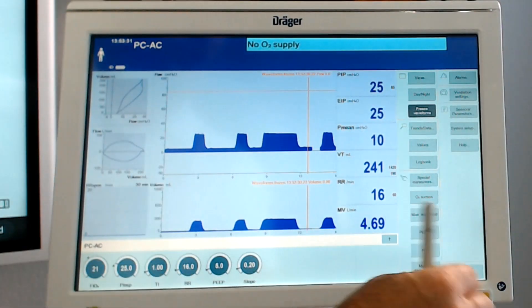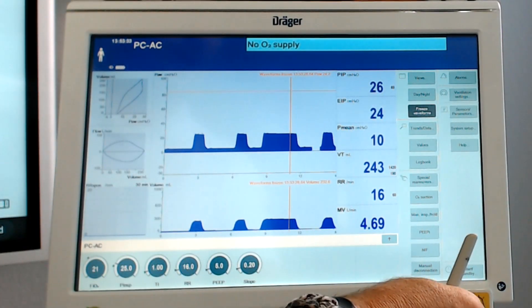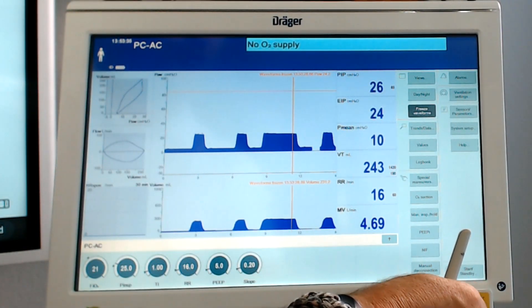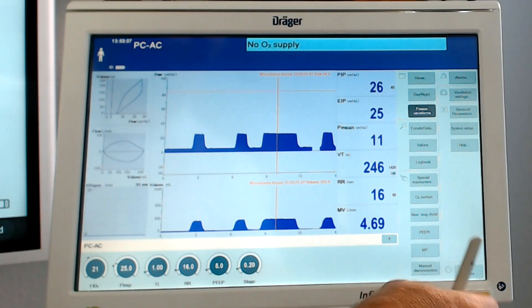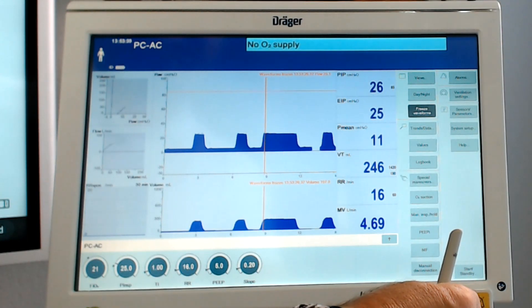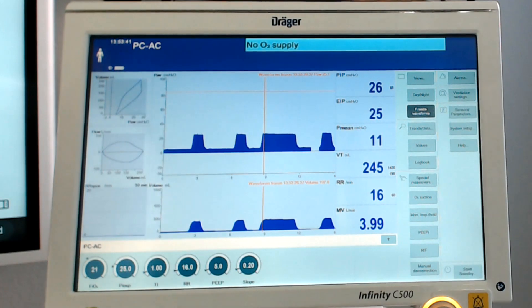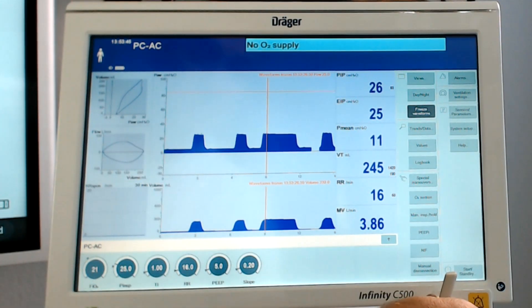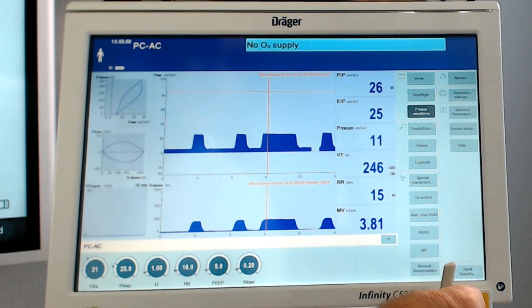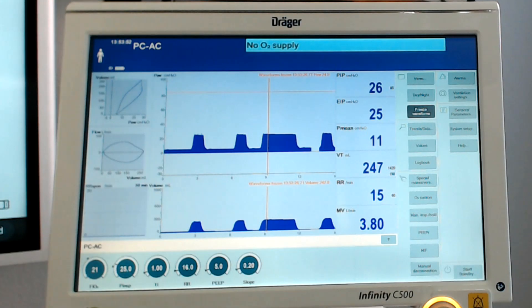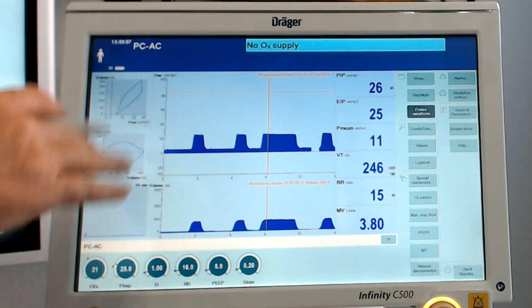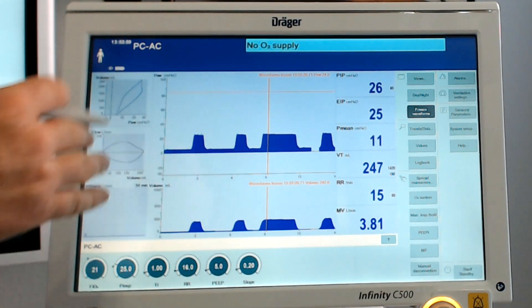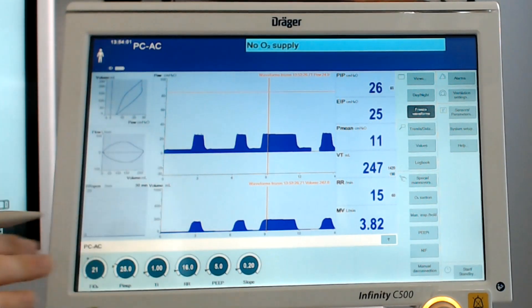Let it go. Let's freeze this and look at our plateau. Our plateau is coming in at about 24. Our peak inspiratory pressure is 25. And when we look at our volume, our peak volume here looks like it peaks out at about 243 milliliters. So compliance has gone down, pressure has remained the same, but we're getting a smaller tidal volume now.